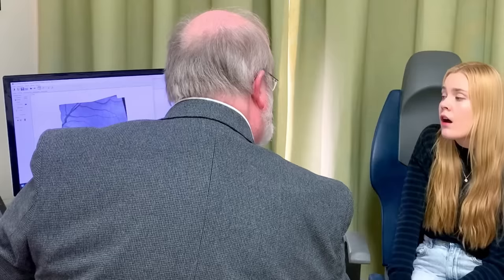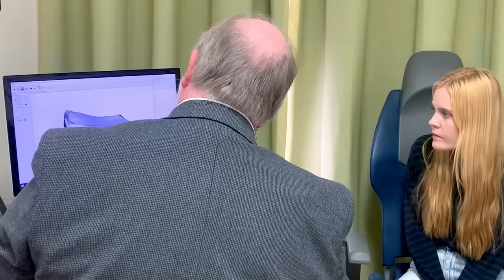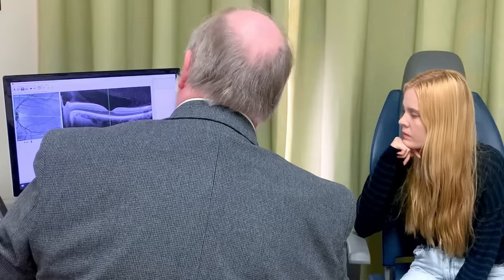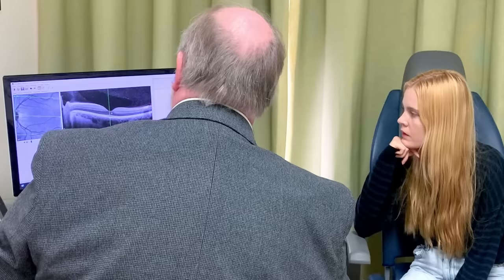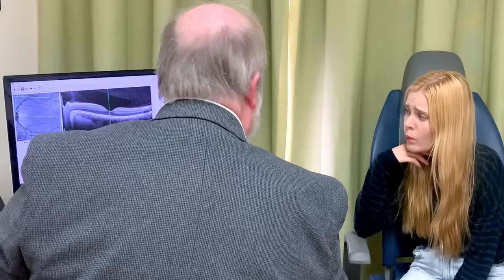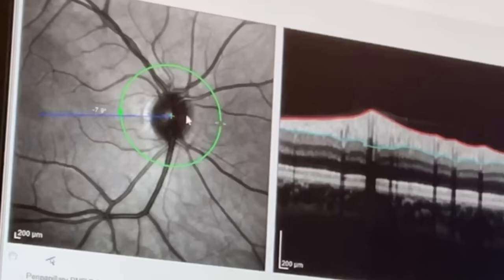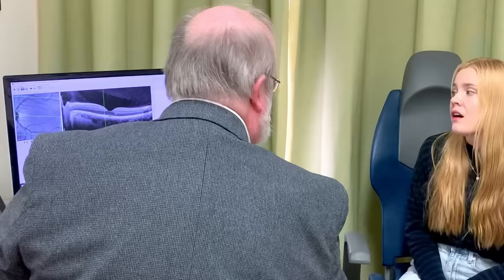So again, same for the left eye. Nice, happy foveal area. If we get a profile again, we can bring that up, and you can see here your nice foveal area. But we're talking what? Thickness of that area, 212 microns. Less than a quarter of a millimetre. That's how thick that is. I can imagine it. Tiny, tiny. And consequently, that area is really small, but essential for our very good vision. If we start losing this, we start losing our very good vision.